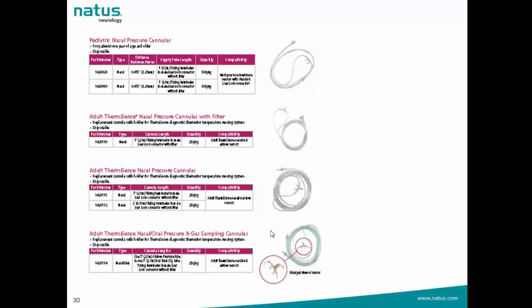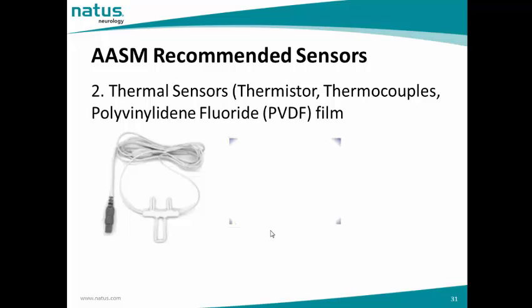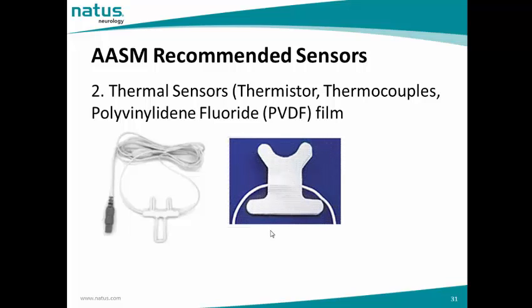This slide shows you the different types of the available nasal pressure cannulas that can be used for the recording. Thermal sensors. Thermal can be thermistor, thermocouples, and PVDF films. This is an example for thermistor. This is an example for the PVDF.